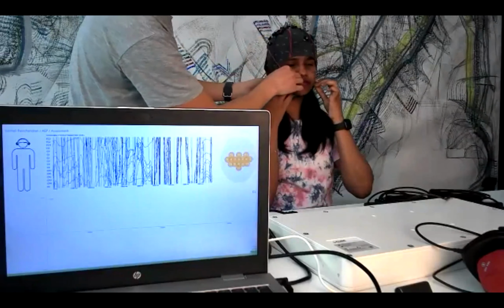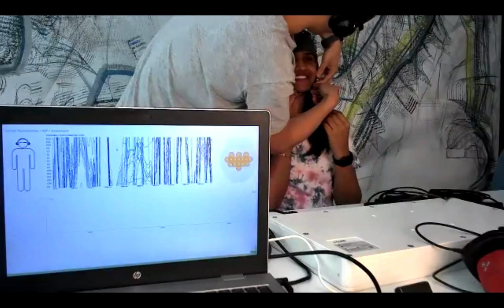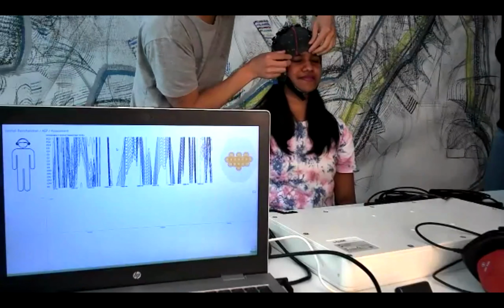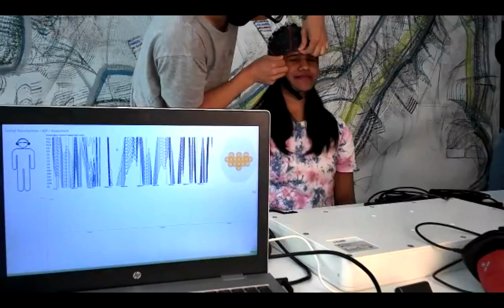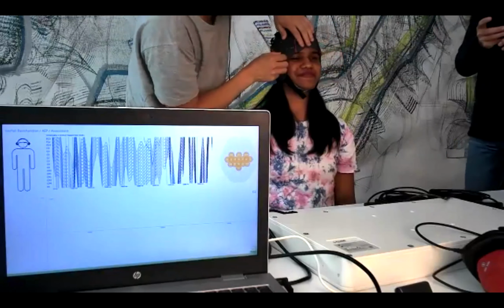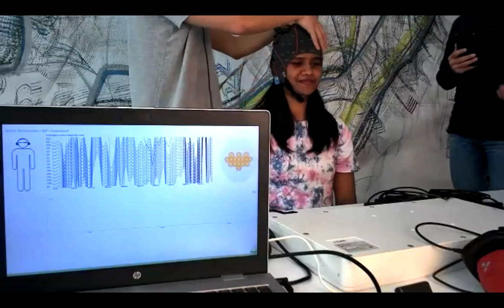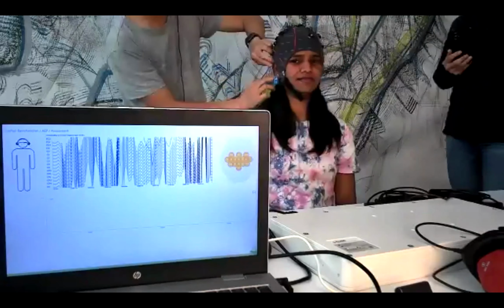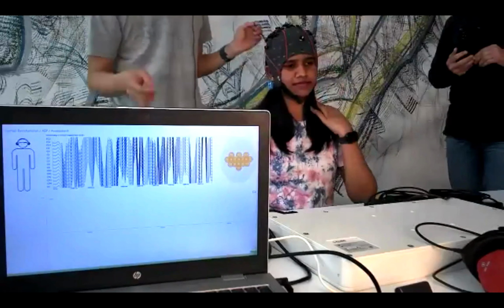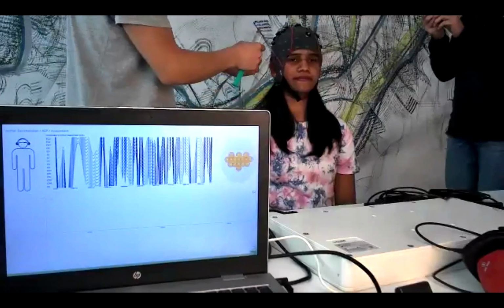It's better. And I'm going to move it a little bit in front, so it looks a little bit nicer to the eyes, and also a little bit more comfortable. Good. Going to check the reference.